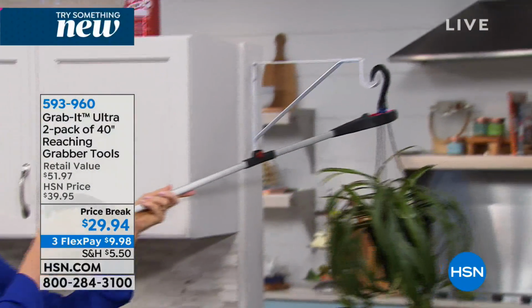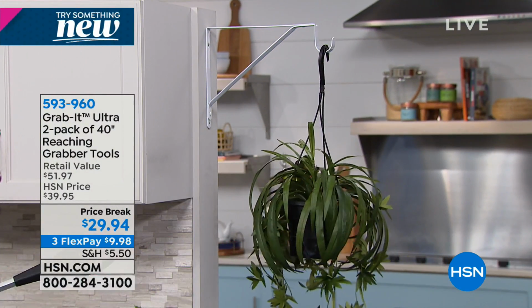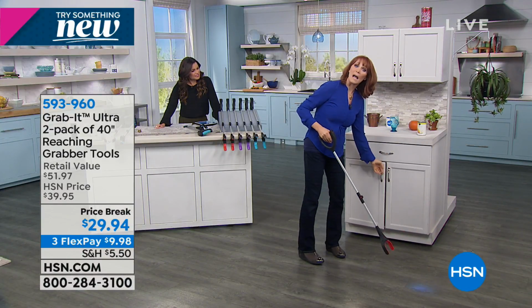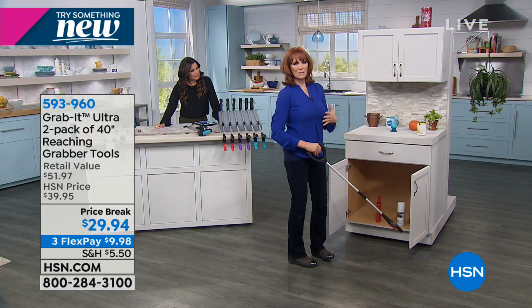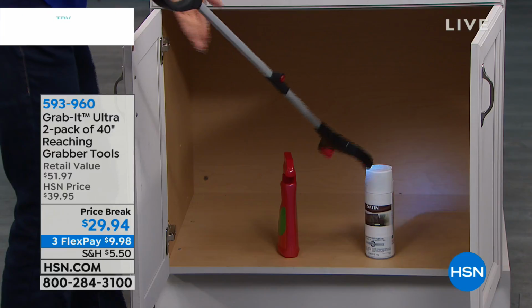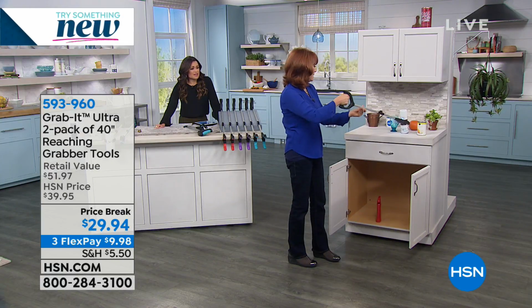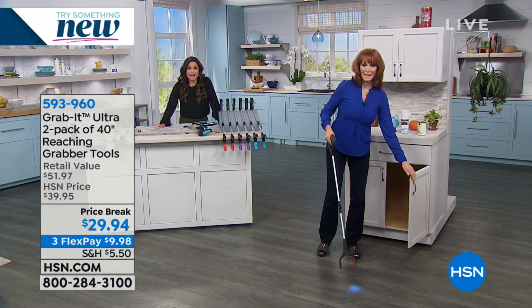Then I can put it back, and you know what? Everybody will be impressed that I did some things while I was home recuperating because I had a handy reaching tool. Now it's not just up, you can also reach down and grab things. If you had surgery, you can't reach low or high because you're not supposed to bend. Well, sometimes getting down is the easy part. It's getting back up. That is exactly the truth.